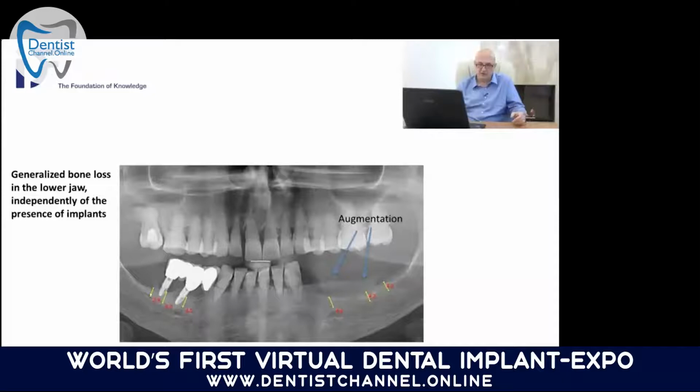I mean, 2 implants here, 2 implants in this front corner, 2 implants there, 2 implants there. And these implants would then be enough for an immediate loading construction. And this case could be solved within 3 days. I'm just explaining this to you to understand that conventional implantology with bone augmentation, with these healing times and so on, is something which basically we don't do anymore.